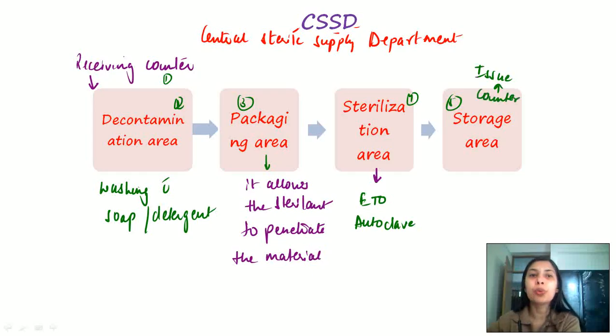Here the things are issued and then sent to various areas in the hospital, like OTs, wards, or wherever the requirement is.